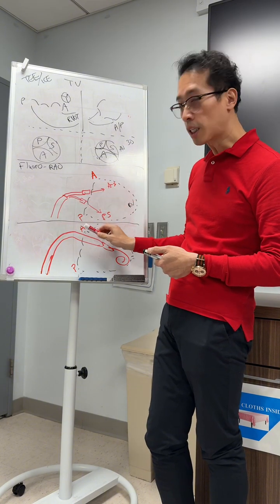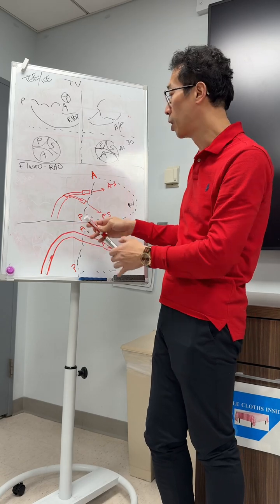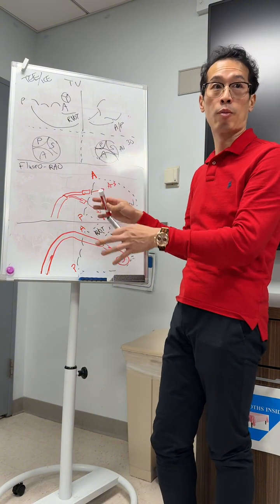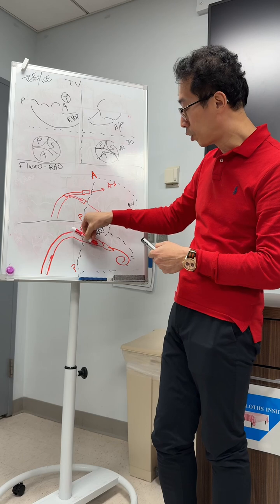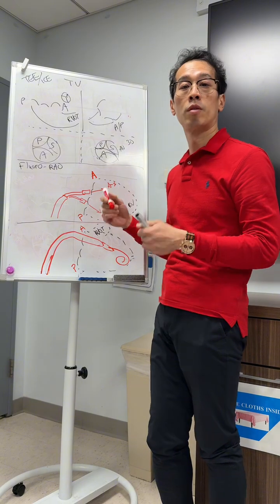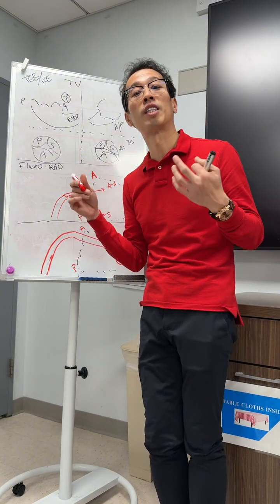Now, with secondary flex, you're just orienting a little bit more coaxial. That's a little bit different. And here you would be doing, for example, the SL knob on the TriClip on the guide to be able to optimize that. So that's the same equivalence. But that's how you know whether you're going to be doing a dive here or not, and you have to be very careful about coaxiality.